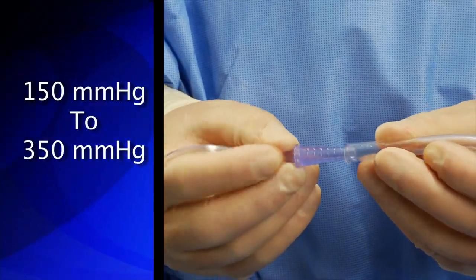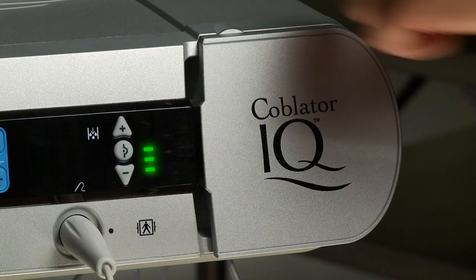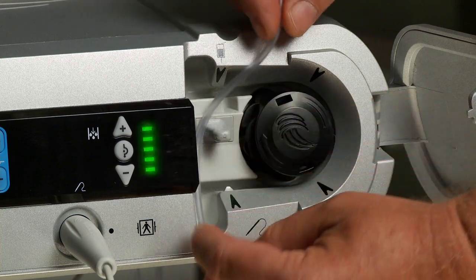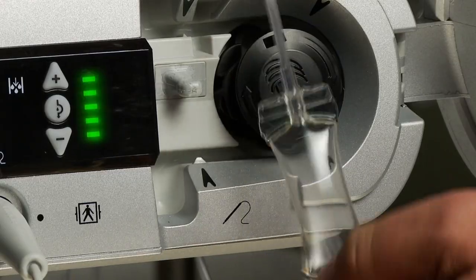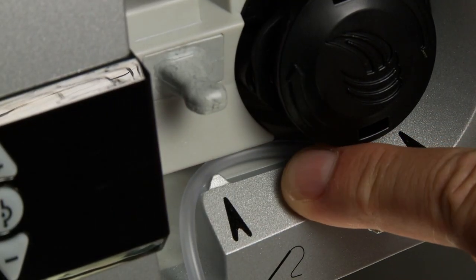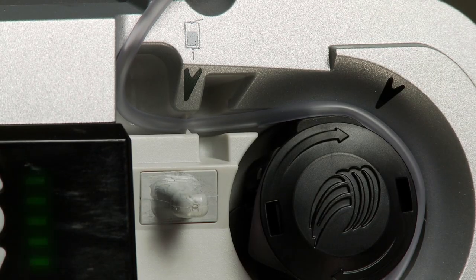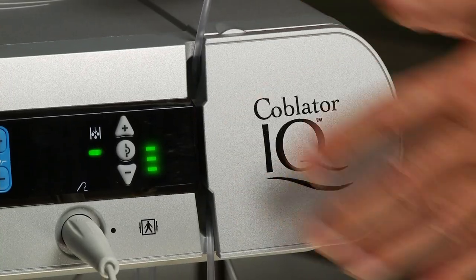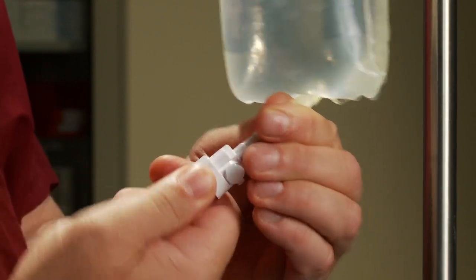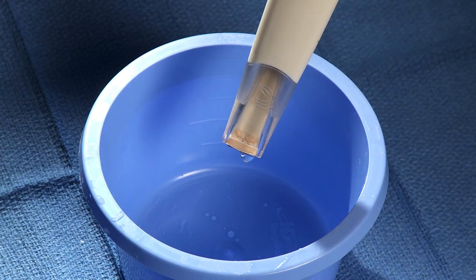Connect the handpiece's suction line with the attached adapter to a standard surgical suction unit. Vacuum should be in the range of 150 mm of mercury to 350 mm of mercury. Open the irrigation pump door located on the right side of the controller and load the saline tubing attached to the wand. Ensure the saline pillow remains below the CIQ controller. Close the irrigation pump door and connect the saline delivery line spike on the handpiece to a bag of sterile saline. Prime saline to the device tip by pressing and releasing the prime button located on the controller.